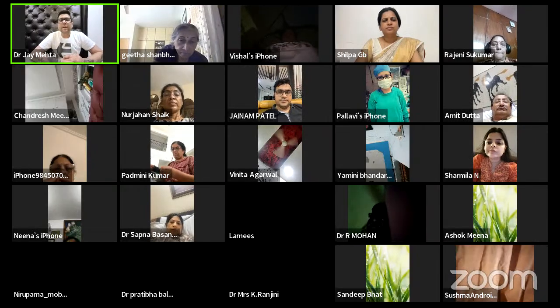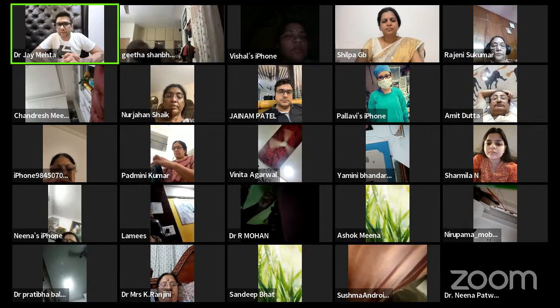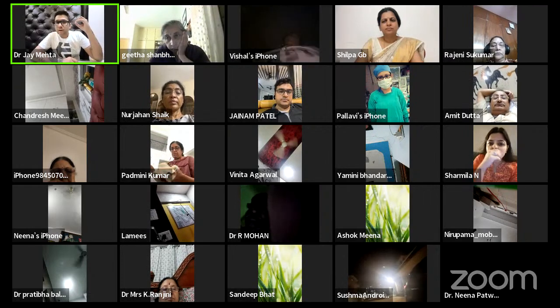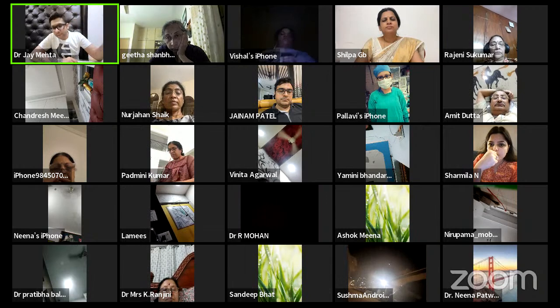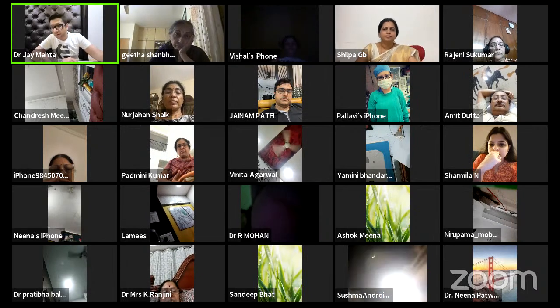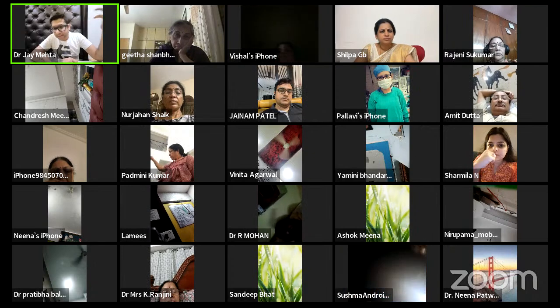All right. Simultaneously, I also want to tell people that whenever we are doing a diagnostic hysteroscopy, you must almost always take consent for an operative procedure as well simultaneously. See, many a time when you put your diagnostic scope inside, you may feel that one wall is pouting in, the other wall is not pouting in, query T-shaped uterus.